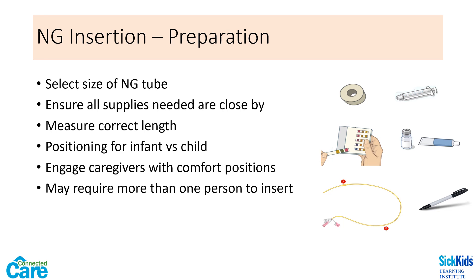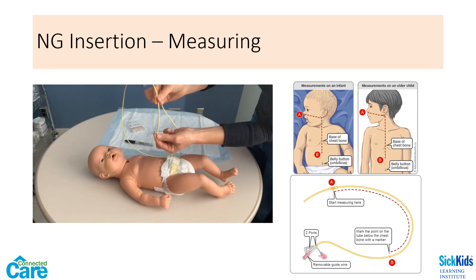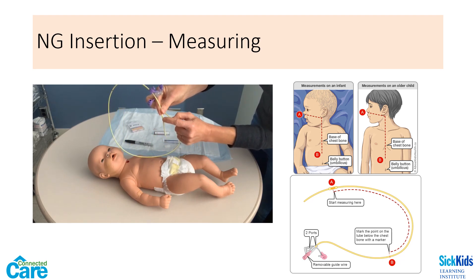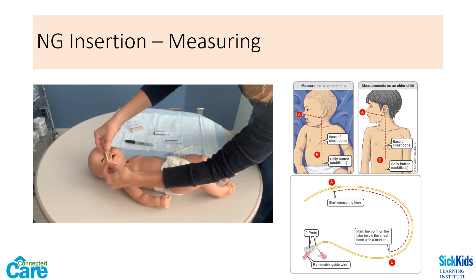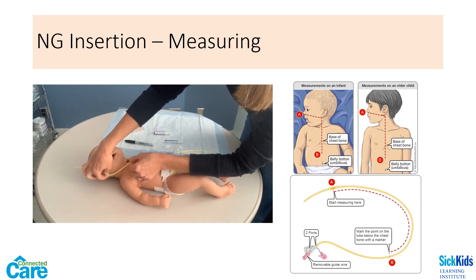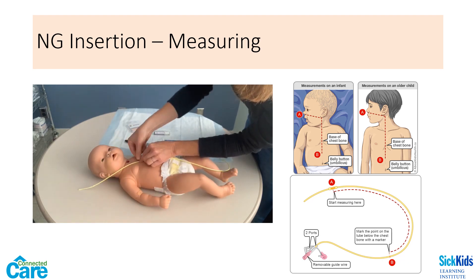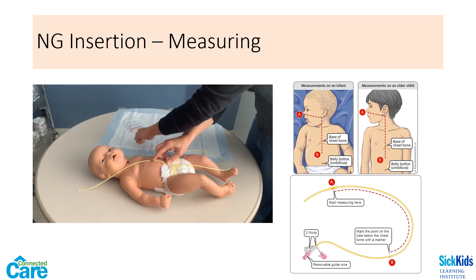When measuring how deep to insert an NG tube, ensure that the infant is lying face-up with their chin slightly raised. For an older child, you may measure the length while they are sitting up and facing forward. Note that there may be a weight at the tip of the NG tube — when measuring, measure from the exit hole and not the tip of the weight. Measure by holding the hole at the nostril, measuring to the base of the earlobe on the same side, then to the midpoint between the base of the chest bone and the belly button. Mark your measurement with a marker.